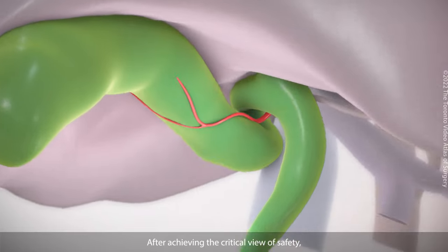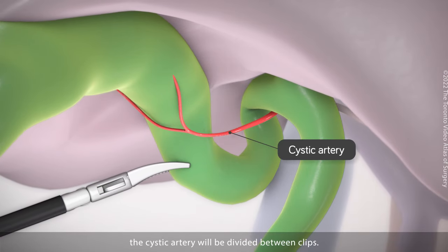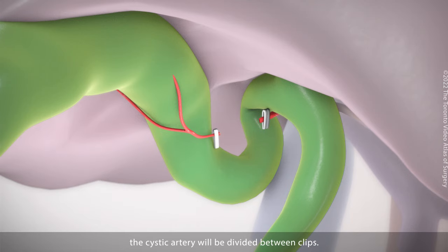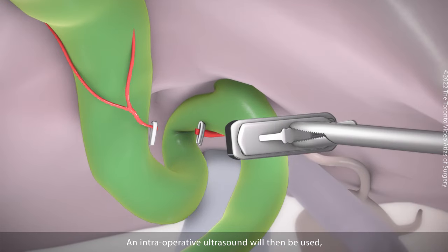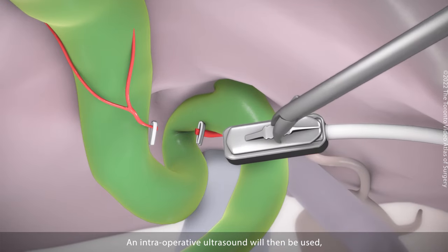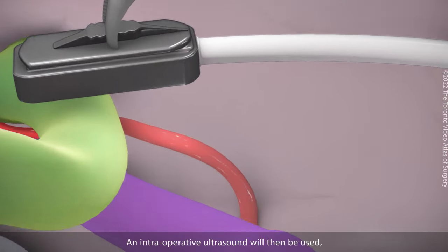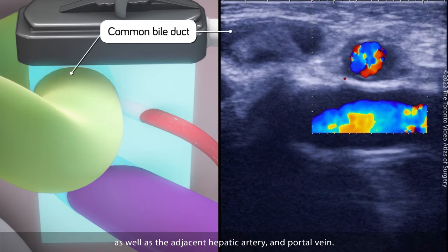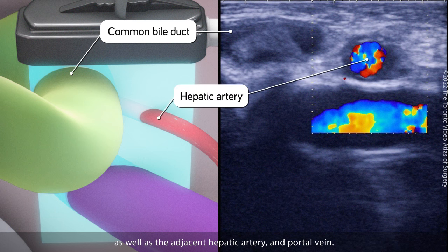After achieving the critical view of safety, the cystic artery will be divided between clips. An intraoperative ultrasound will then be used to confirm the location of the common bile duct, as well as the adjacent hepatic artery and portal vein.